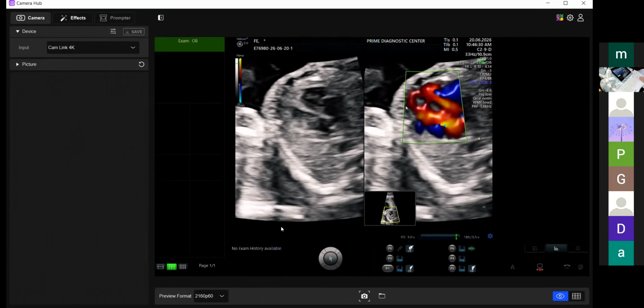This is pericardial. Small pericardial fluid is always present, and done, beta. All good. Thank you, beta. No, we'll do it later. Okay, I think because we are on a side by side, so we will not get an award. We'll do it again.